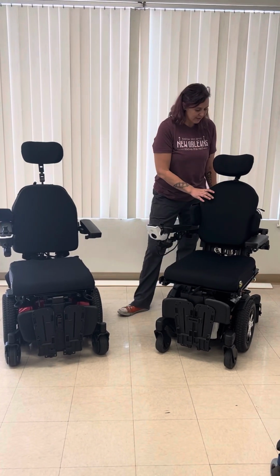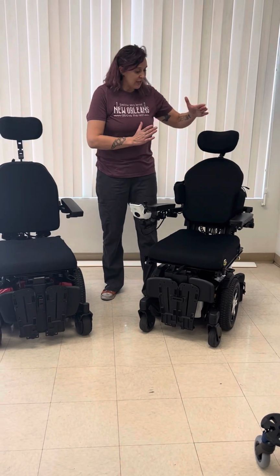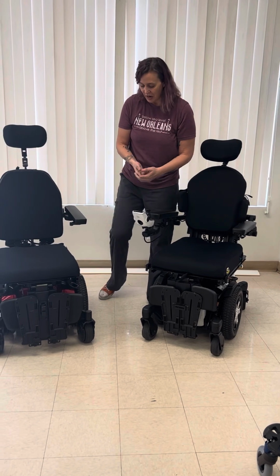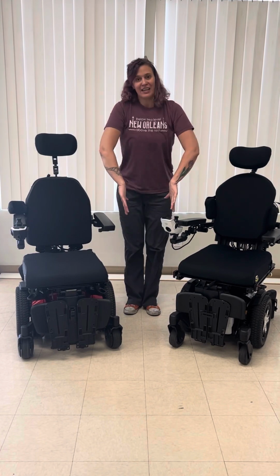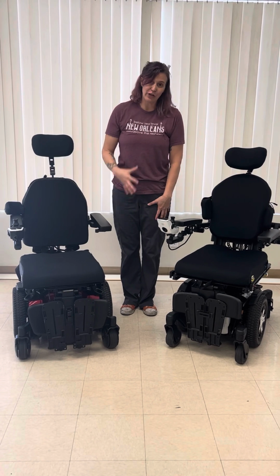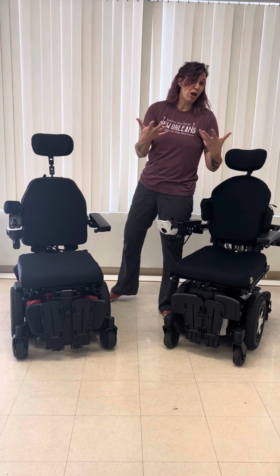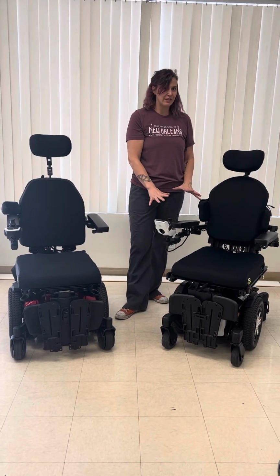If the backrest is 16 inches wide, okay, so if you're a little more narrow, then you can have the armrest be within that base frame, because that's often what hits first, is the armrest. With both of these, you can see the armrest is kind of outside of the frame of the wheel. And so that is something to consider as far as how tight you can get the arms to allow you to go down these spaces. So just because you're getting a base that's 21.75 inches doesn't mean it's going to go down a hallway of 22 inches, unless you're talking about where the armrests are and making sure that that's set as well.